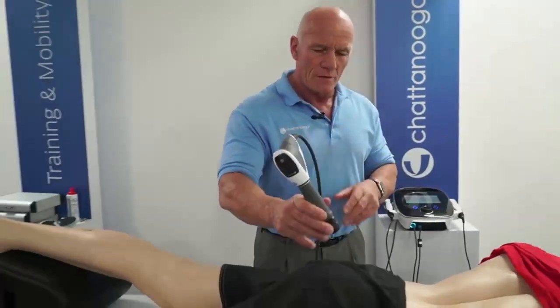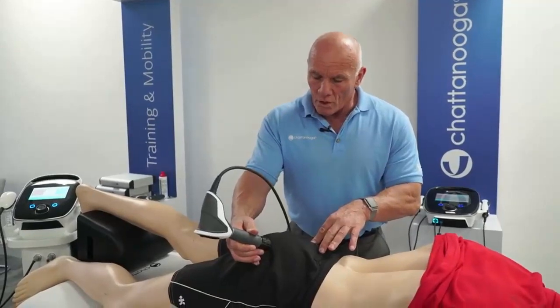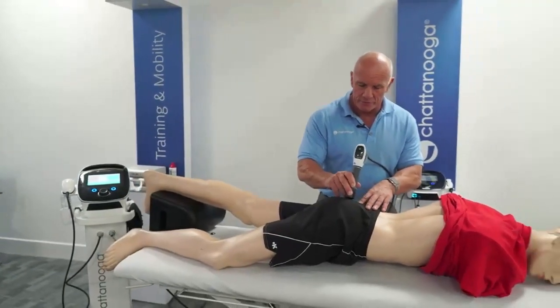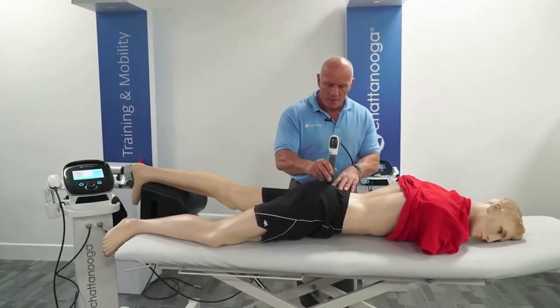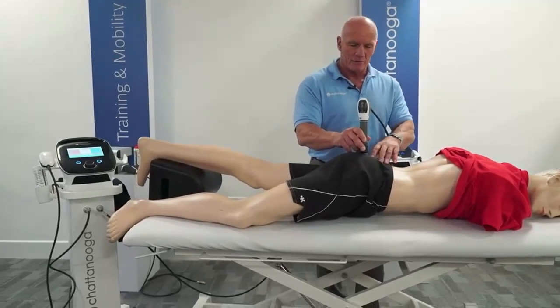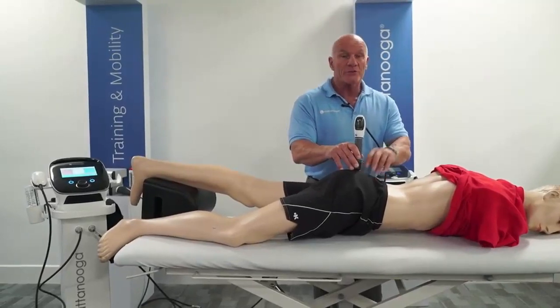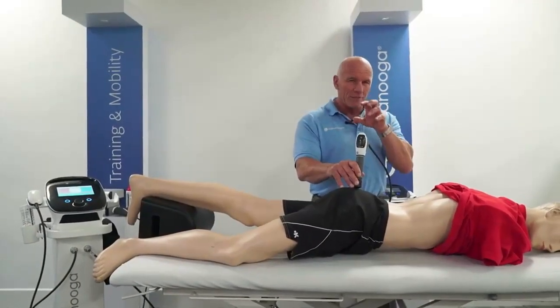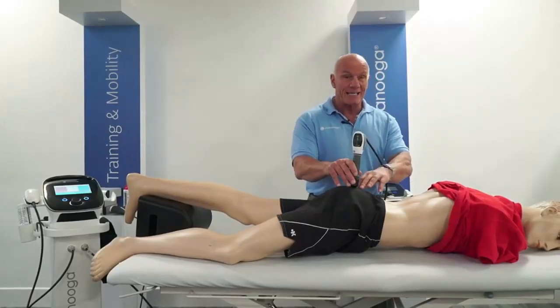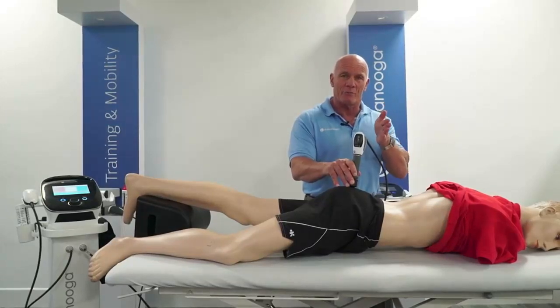So what I'm going to do now, I'm going to work across the tissue with that 4 hertz until such time as the patient says, oh, I'm starting to feel that. Now, I'm over the trigger point, but the locus, that's not the center, the locus is where the trigger point stems from. That can be as much as 4 centimeters away from where you start to palpate a myofascial trigger point.